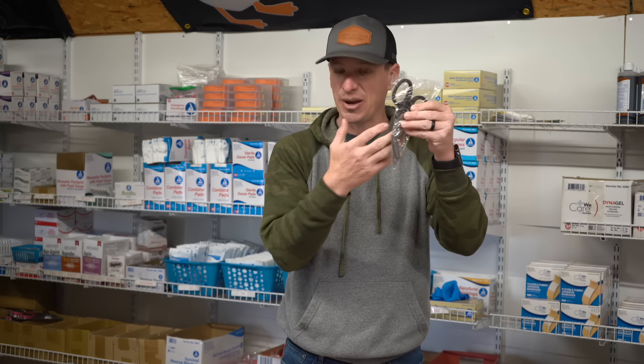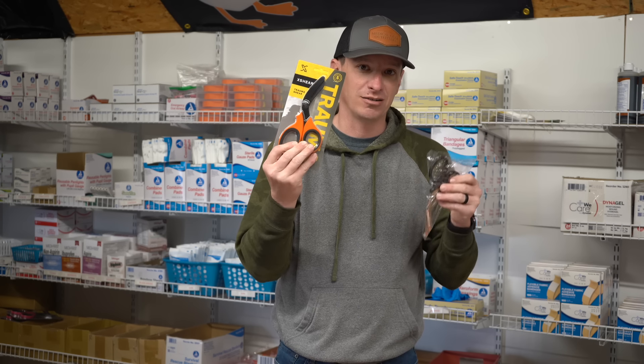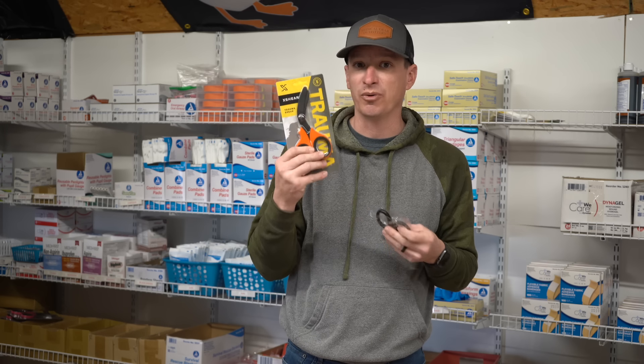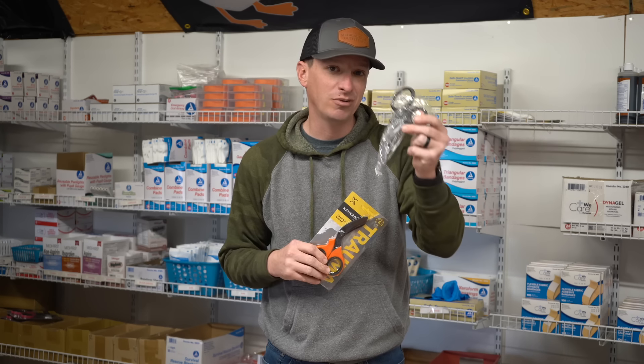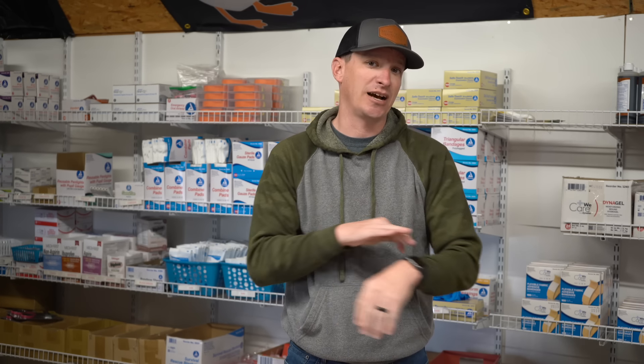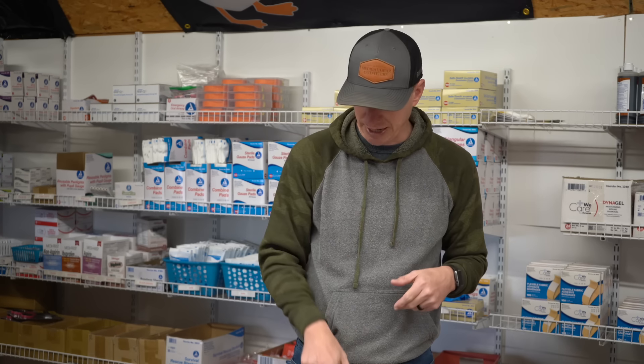Scissors — you've got to be able to expose your injuries. Whether you run the cheap EMS scissors at about five bucks a piece, or want a nicer pair like the X Shears, it's up to you and your budget. For most people the cheaper ones will work just fine. Hand sanitizer is something to look at too — you may get blood on your arms above the gloves, so take the gloves off and use hand sanitizer until you can get to warm soapy water.